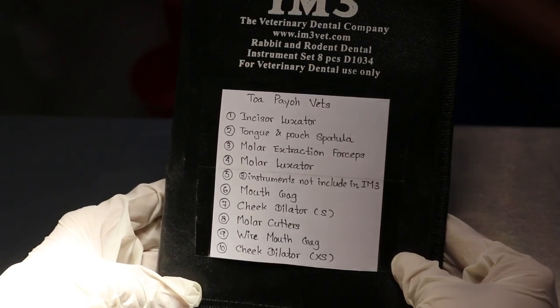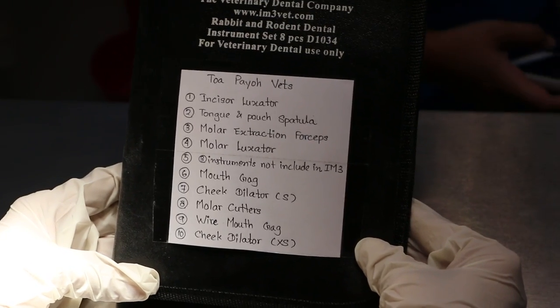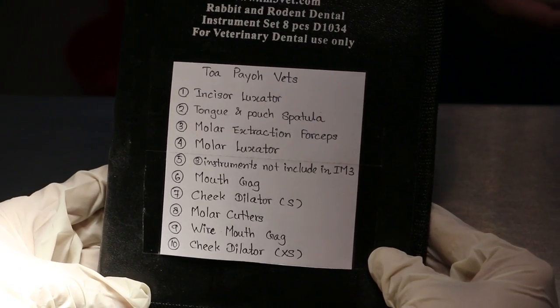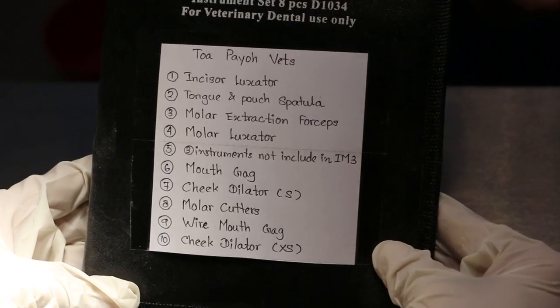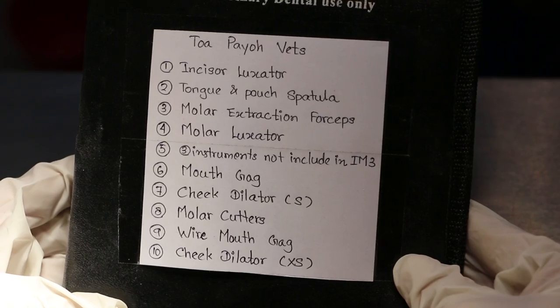In this bag there is a list of instruments especially for rabbit or rodent dentistry. We will show the list and then read through it.